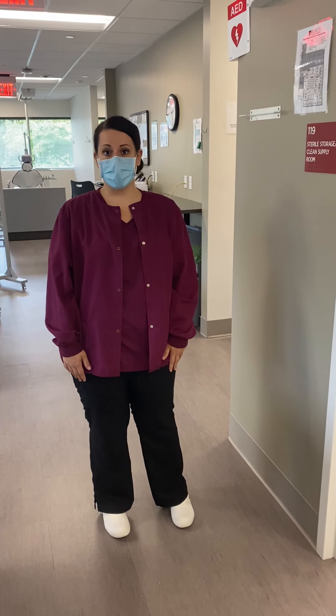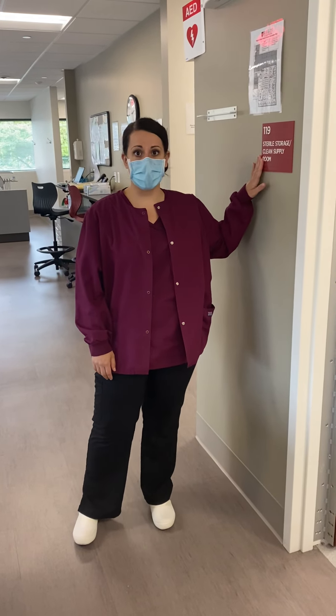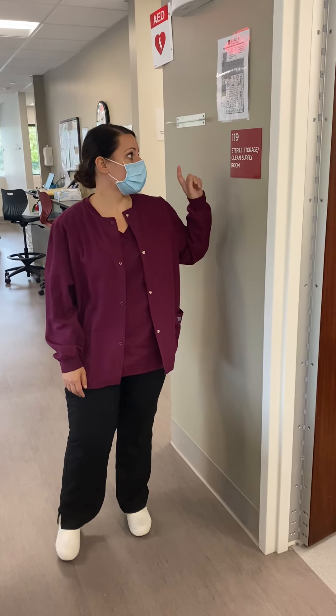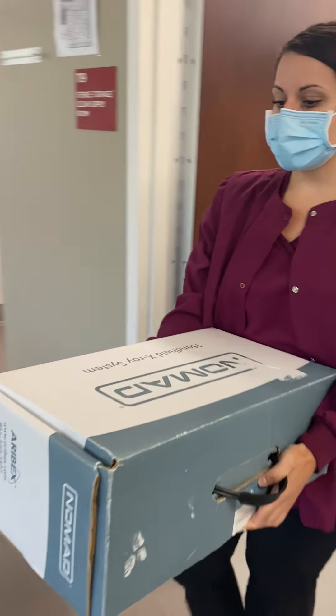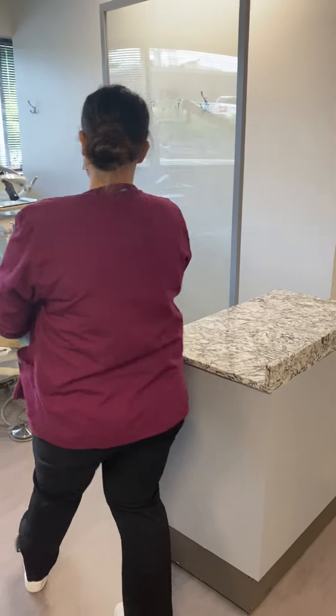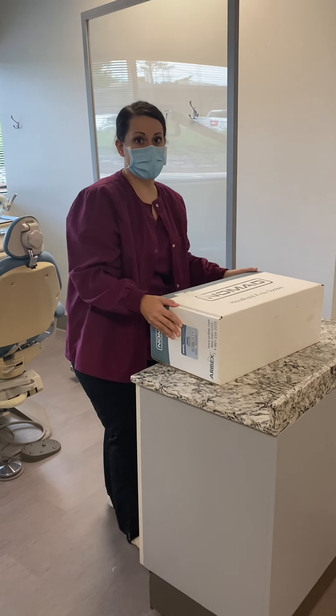So now we're going to show you where the Nomad is kept. It is in the same closet as the sensors, in a sterile storage supply. This is the Nomad — you can see a label right here and the box says Nomad. Also on this shelf, this is the second battery we have. Once the battery inside is dead, we're just going to switch them out. When you're in clinic and not the radiology lab, it's going to be the clinic aide's responsibility to retrieve the Nomad in between each session.